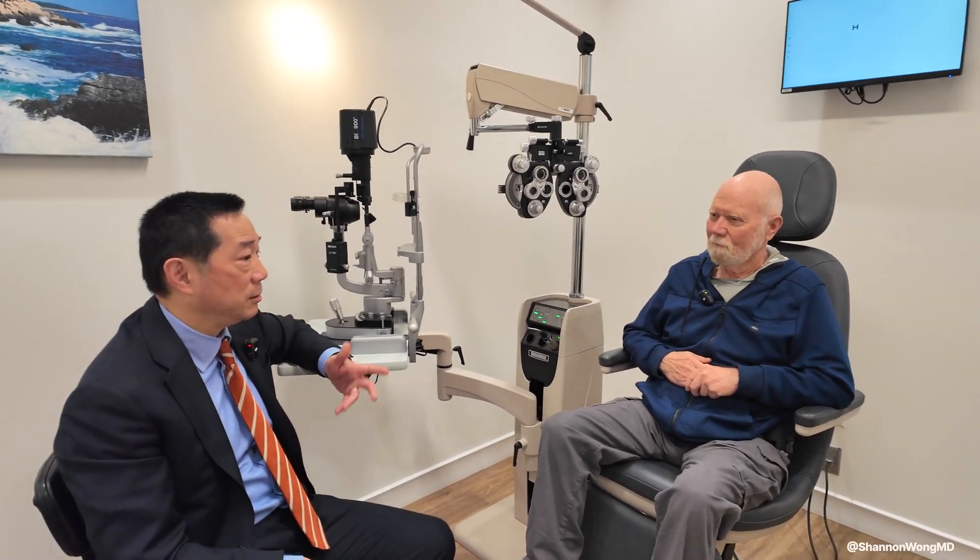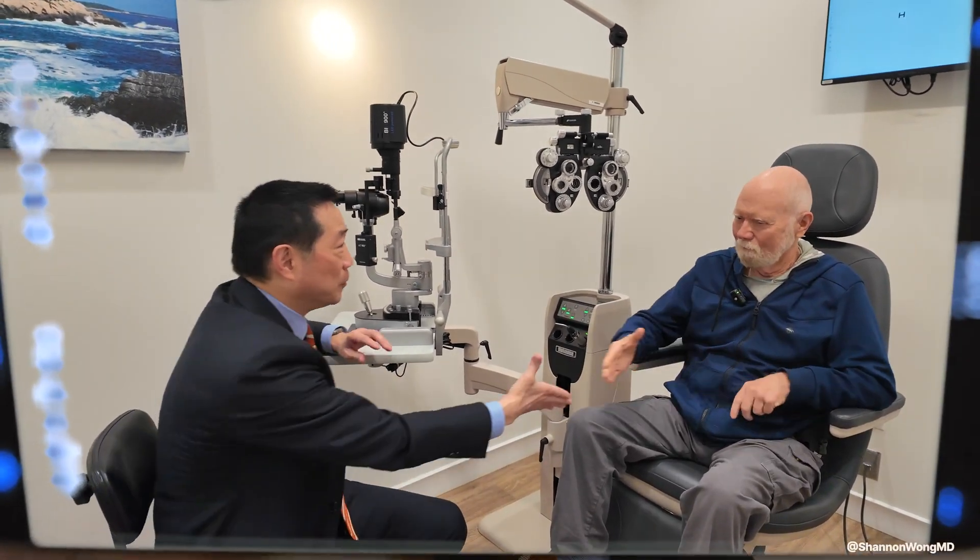Thanks for coming to see us and have a good trip home. Astigmatism correcting lens implants are highly effective 99-plus percent of the time. However, in about 1% or fewer of patients receiving these implants, the lens implants might rotate out of their intended position. The simple solution is to go back in, rotate the lens into correct alignment, and the patient should see well quickly.